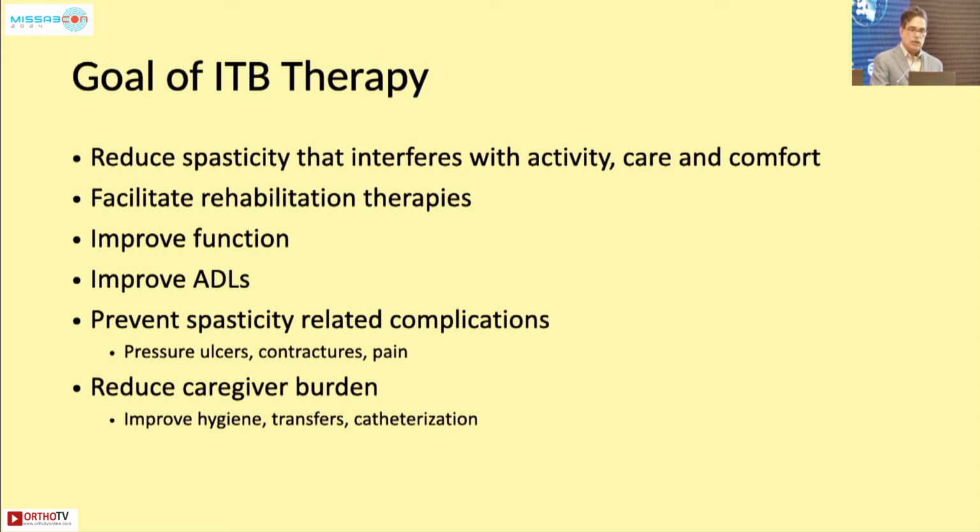The goal of this therapy is that it improves activities of daily living. In the non-ambulant patient, it helps the caregivers clean the patient's private areas. They're able to abduct the hips. It improves hygiene, transfers, catheterization, and things like that.